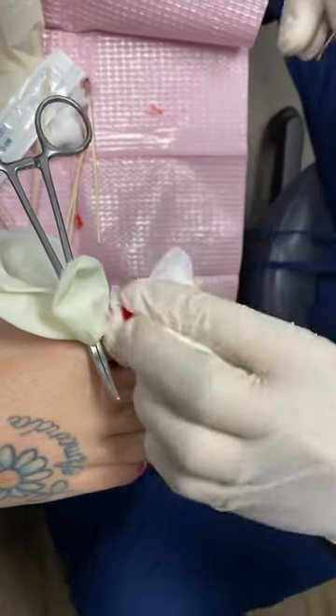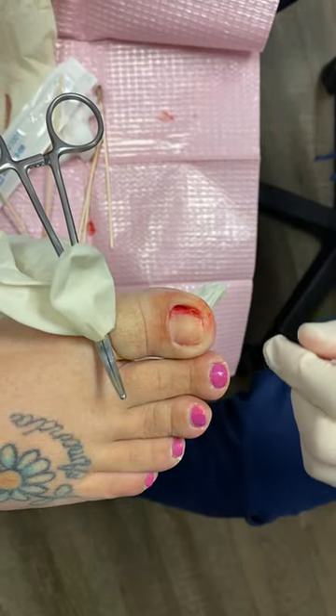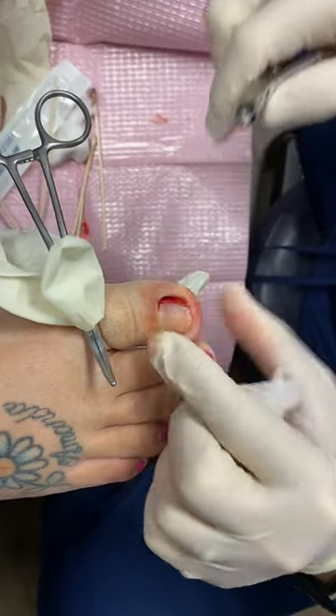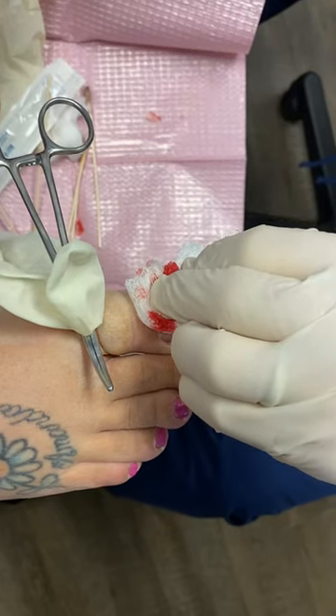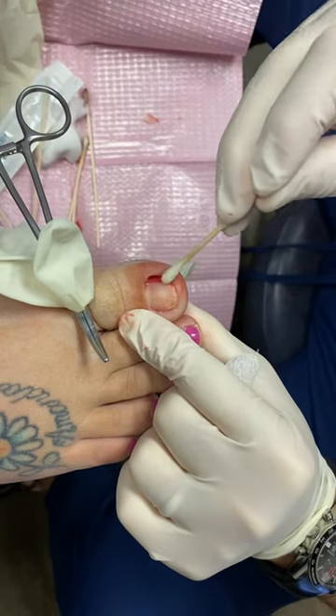By scraping the nail cells away, that can help eliminate those nail cells so they don't regrow. The whole point of this procedure is to remove the nail so that it does not come back. The nail will be permanently smaller, and this procedure is called a partial nail avulsion, with phenol and alcohol matrixectomy.